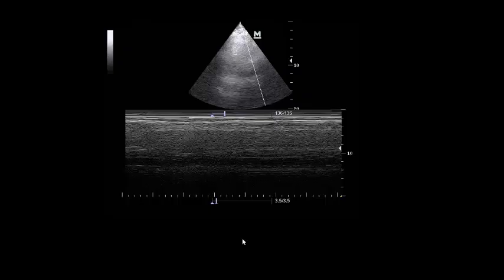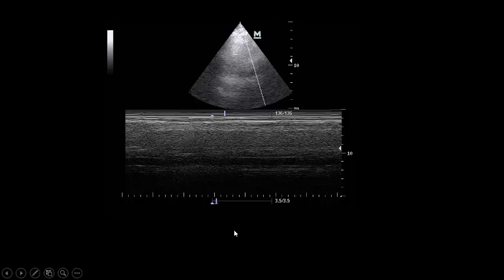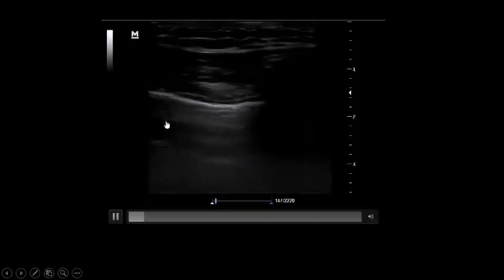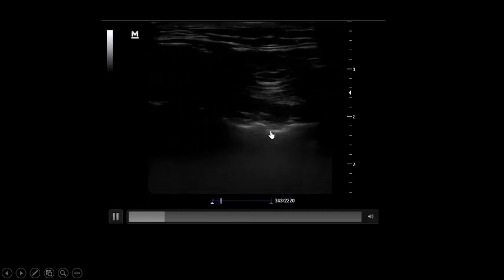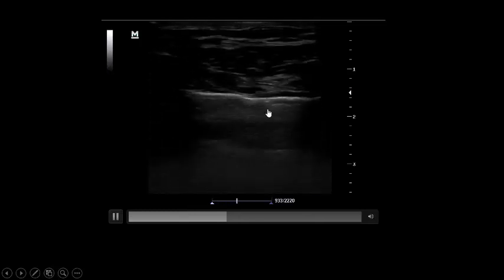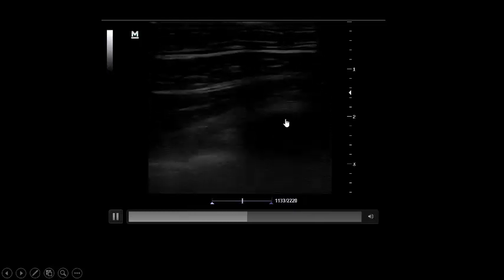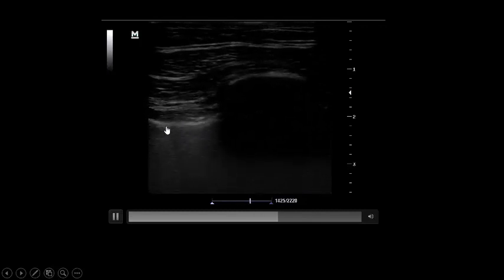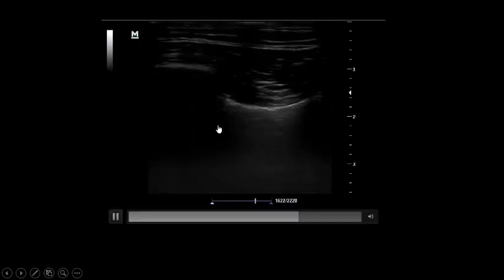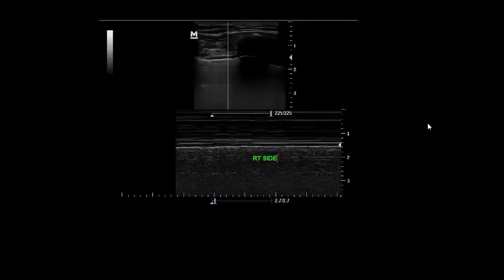The IVC is still non-collapsible and dilated — no hypovolemia or bleeding in this patient. We assessed for lung sliding. There is bilateral good lung sliding. Good sliding confirmed in multiple zones — no evidence of pneumothorax. Moreover, there is a seashore sign appearance which excludes pneumothorax. So: no hypovolemia, no pneumothorax.